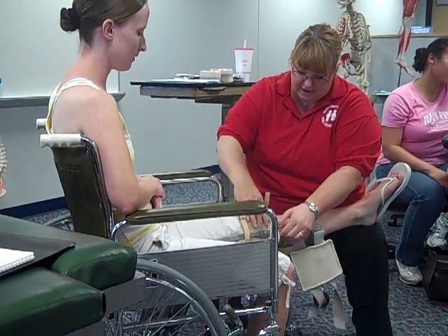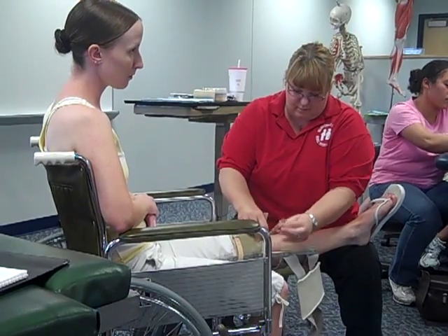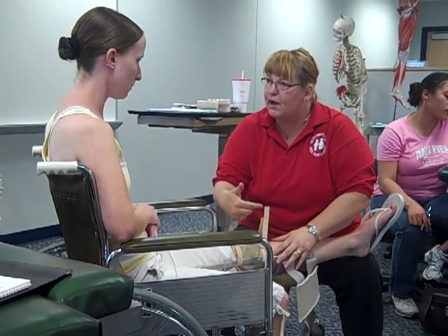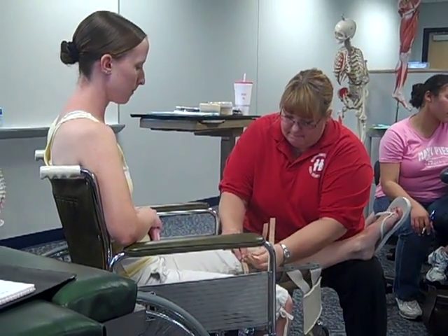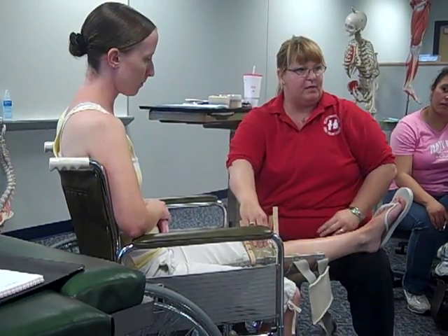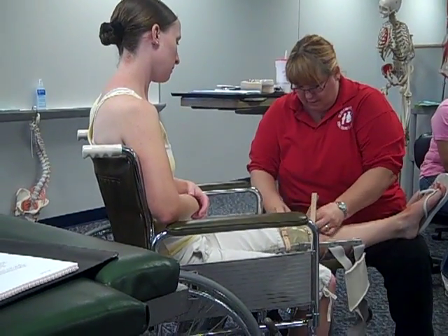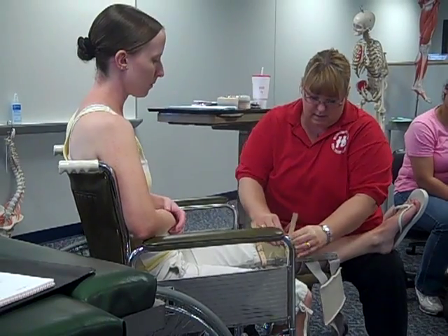As I tighten on this side, I'm going to make sure it tightens right down evenly over the patella. If it isn't even, I can adjust side to side as I go. I want to check whether it feels too low or is pushing down on the patella. I have a tentative fit — I'm going to feel for her patella. I can see how loose it is, so I know it needs to be tighter — I should just barely be able to get my finger in there. I'll keep tightening until I get it where I want it, checking for the patella. I could probably go one more.